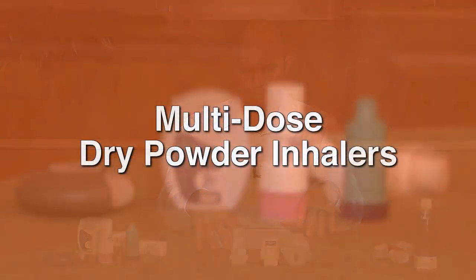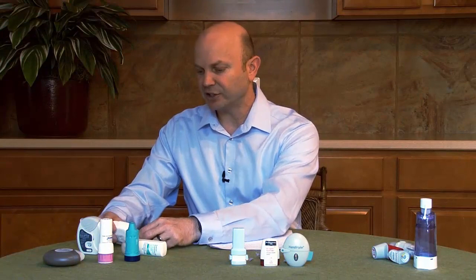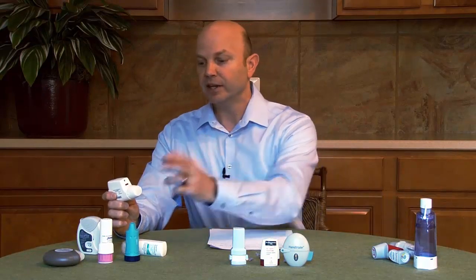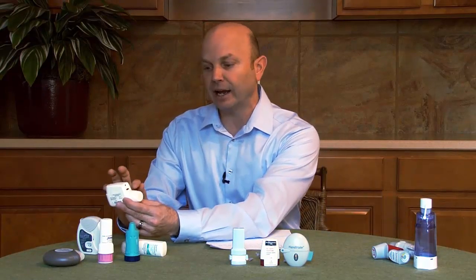Now we're going to talk about multi-dose dry powdered inhalers. These devices, you'll notice, all come with a counter. These devices you also do not need to clean. The other two devices need regular cleaning, and refer to the manufacturer's instructions for that. Once these reach 0 on the dose counter, you will discard them and replace the entire device.